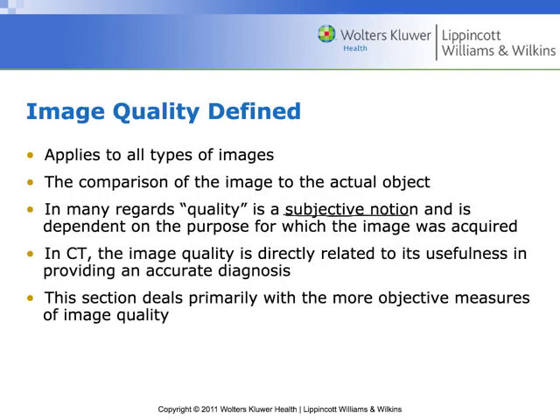The main thing, though, at the end of the day, is did you get a picture that has diagnostic quality? Is it something that I can look at, and if there's pathology present, I can make that determination, yes, there's pathology present in this image. If I make an image that in some ways obscures pathology or doesn't indicate where the pathology is at appropriately, like for example, I produce a CT image that says there's a mass in the left kidney, when in reality I didn't flip the thing correctly and the mass is in the right kidney, that's a problem. Right? That's a big problem.